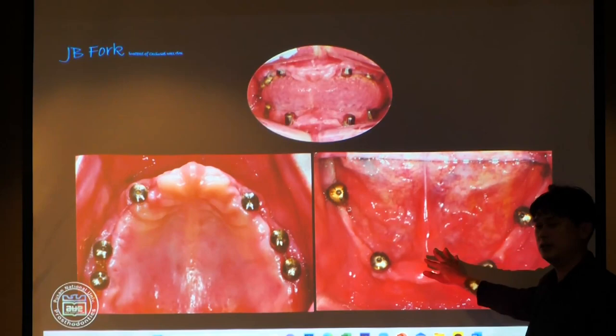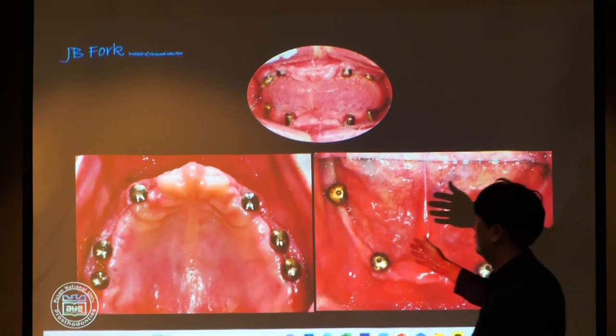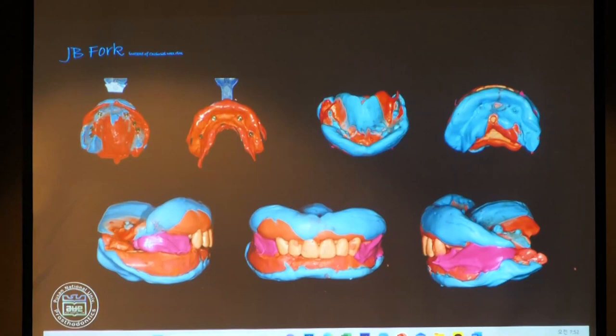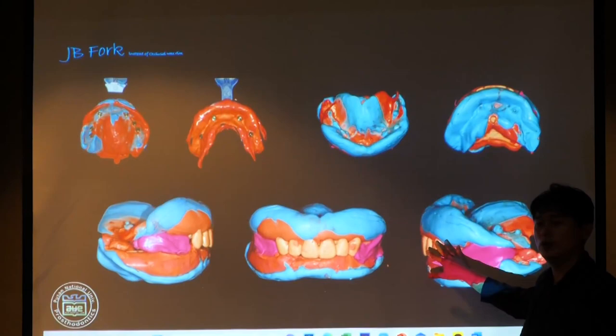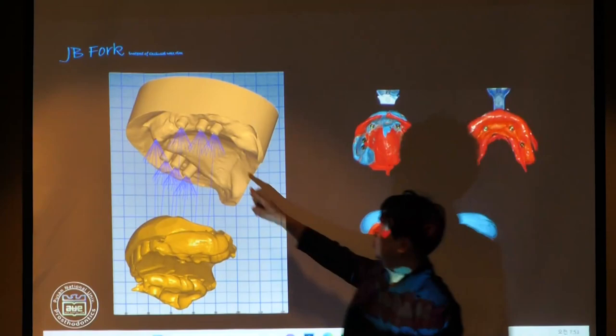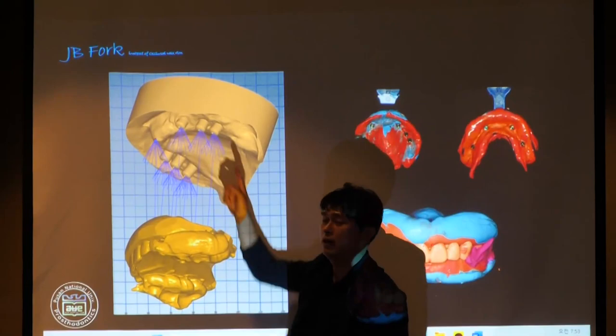Look at this case. After inserting the implant, I decided to make the immediate denture. I didn't proceed with immediate loading in that case because I did the sinus lift procedure. So after impression of the upper and lower jaws, I take the bite jaw relation using the JB fork. And then we mark very easily. Click, click, click, click. And automatically the model can merge together very precisely. So it's very important to click unmovable, non-movable points. You know?